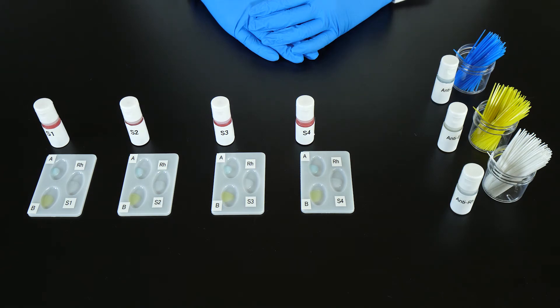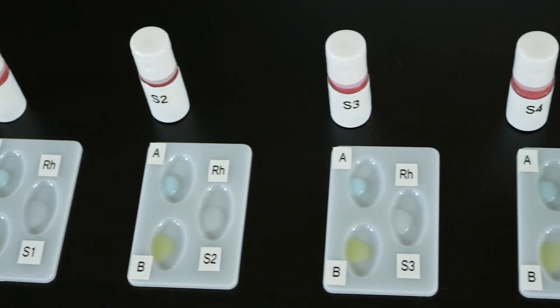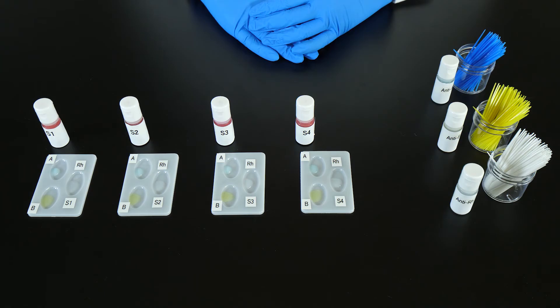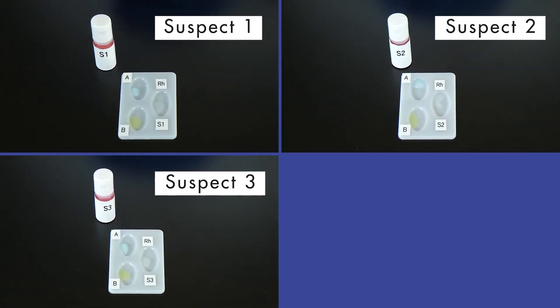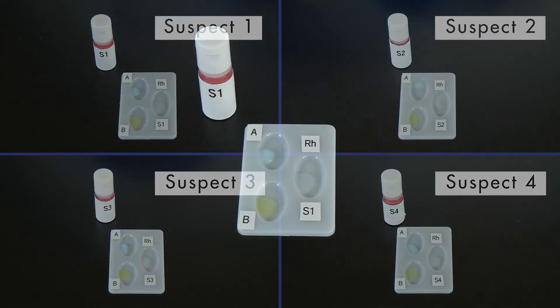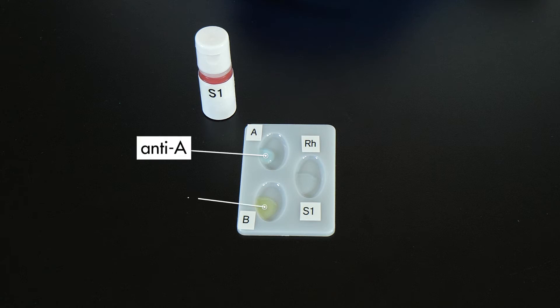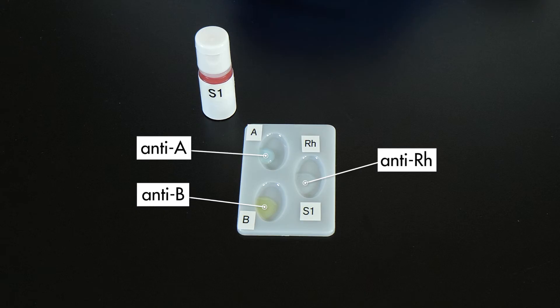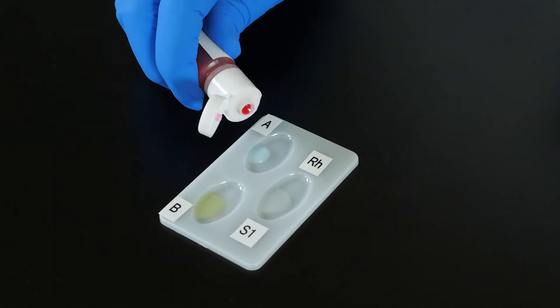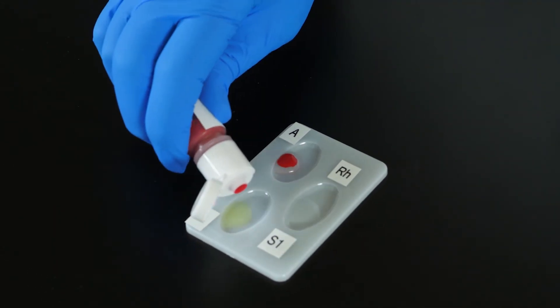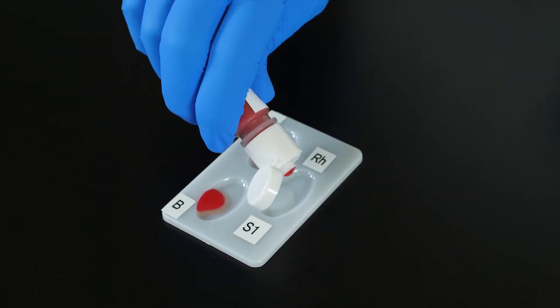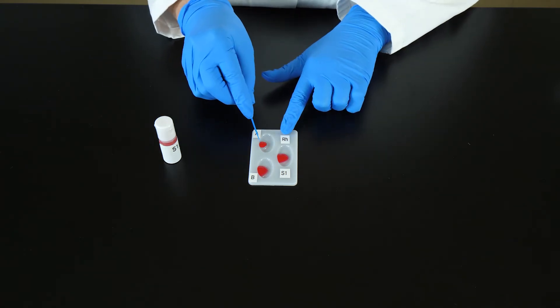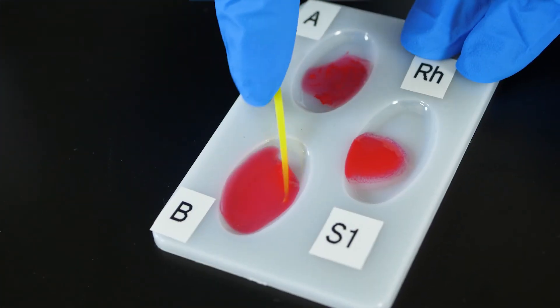Now that we have a better understanding of blood types, it is time to test the blood samples of our suspects. We use special slides with wells to contain the drops of blood and serum. We have a separate slide for each suspect and have labeled the slides S1, S2, S3, and S4. On each slide, we have also labeled the wells A, B, and Rh for the serums we will use to type the blood. A few drops of each serum have been placed in each of the respective wells. Next, we carefully place a drop of blood from the suspect 1 bottle into each well on the slide labeled S1. To prevent contaminating our samples, we use a different stick to mix the contents of each well.